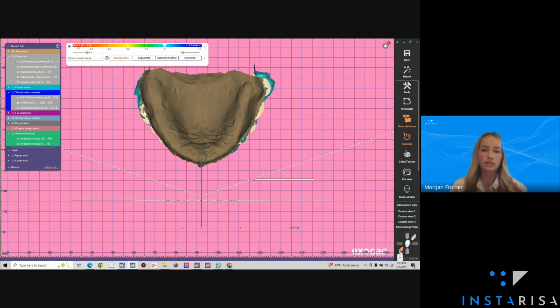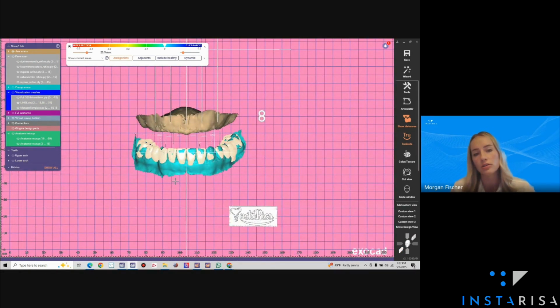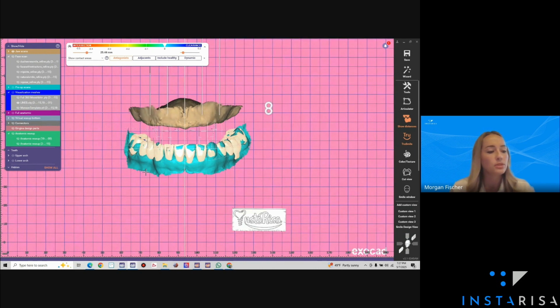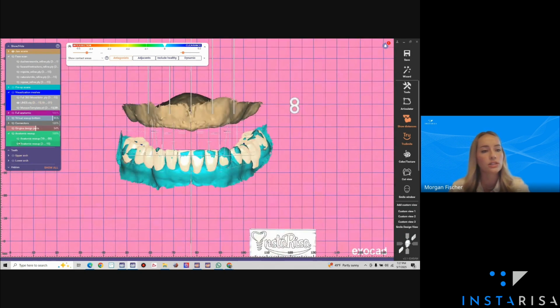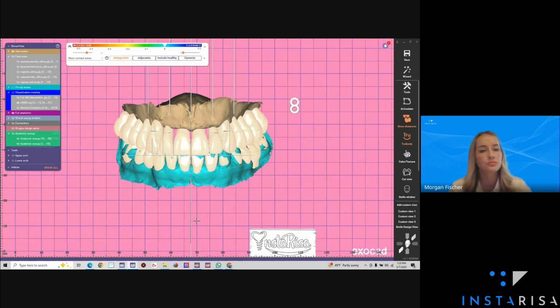And that's not always going to be anatomically correct, but it does tell me in this case, it looks like it's right on. So I'm very confident in having our incisal edge position set here. Luckily, it's also going right through 24 and 25. So I think we'll be able to achieve really nice aesthetics with that. So yeah, step number 1, always starting with the midline. Step number 2 is always going to your smile curve. So let me turn the teeth on fully here.